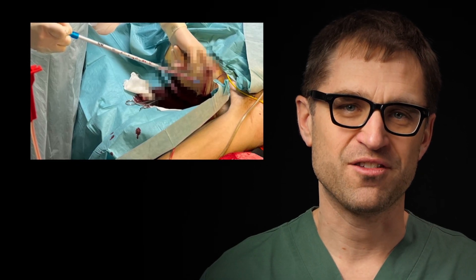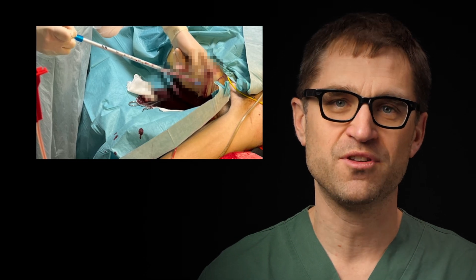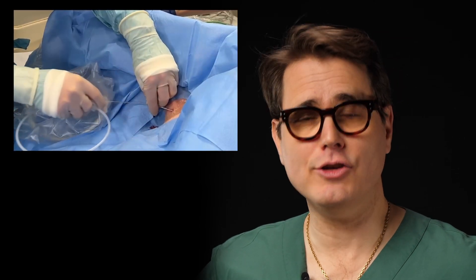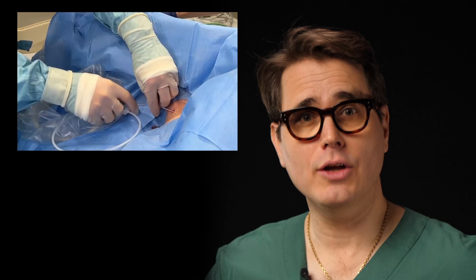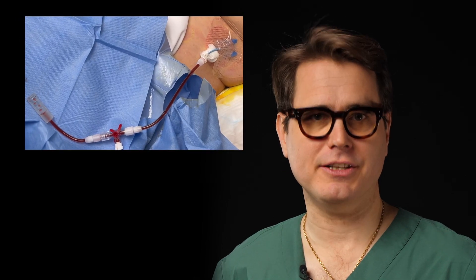A large-bore safe triangle chest tube is rarely the best technique to treat a pleural effusion, except perhaps in torrentially bleeding patients. In most cases, your patients will be better served with an eight French pigtail catheter. This is commonly used, but we will demonstrate how you can use the in-plane Seldinger technique you already master from CVCs to achieve better tip placement, greater patient comfort, and better safety.